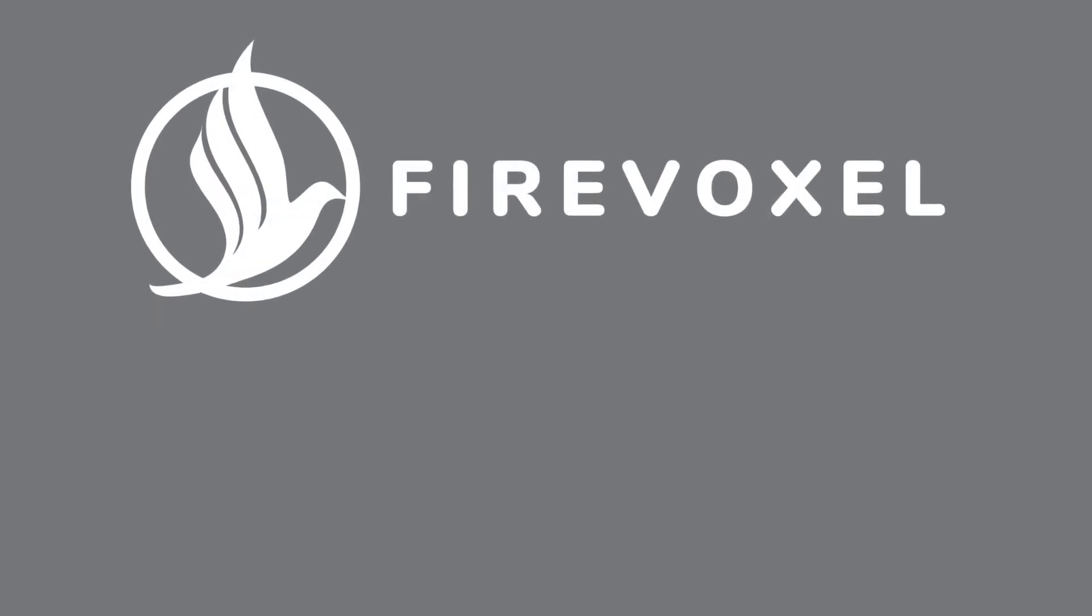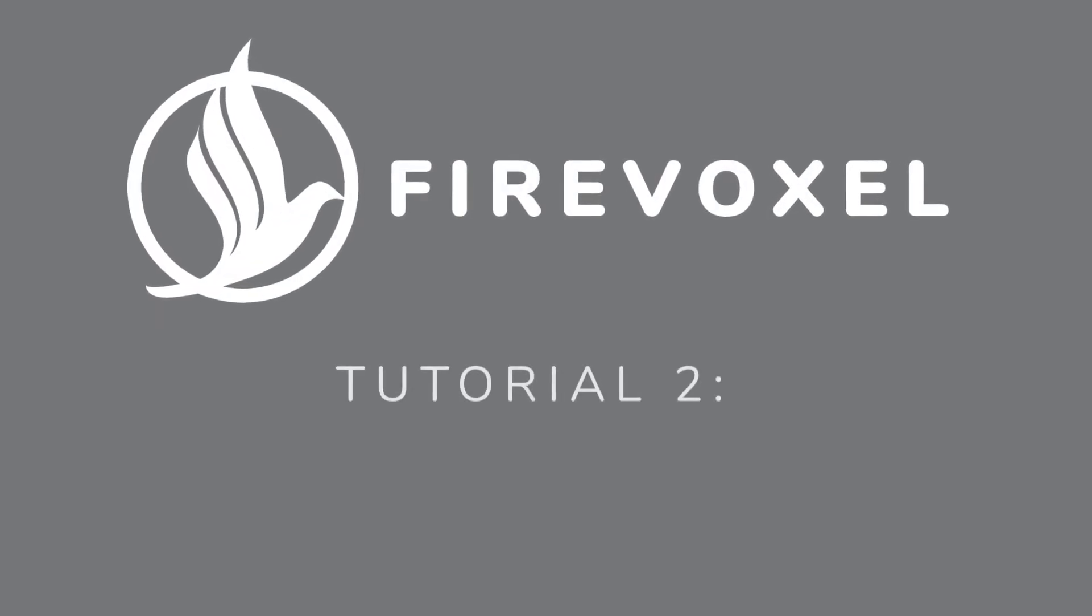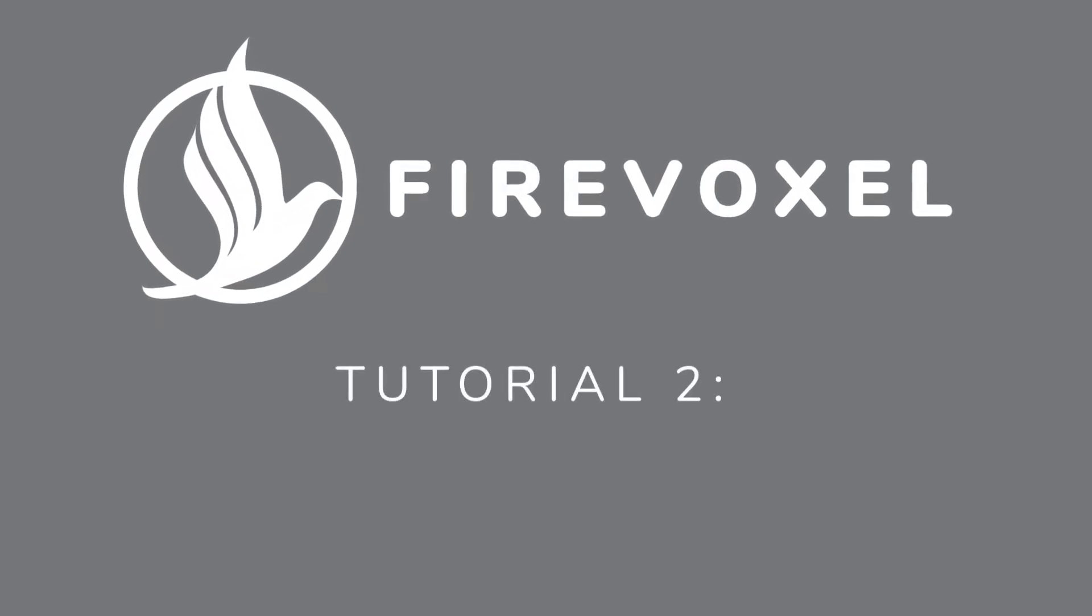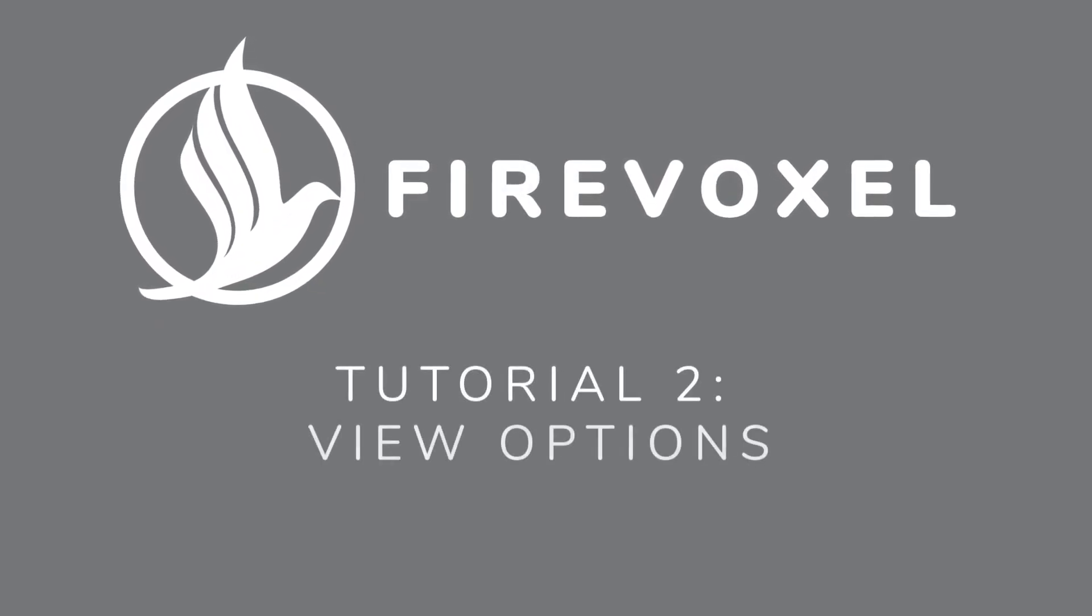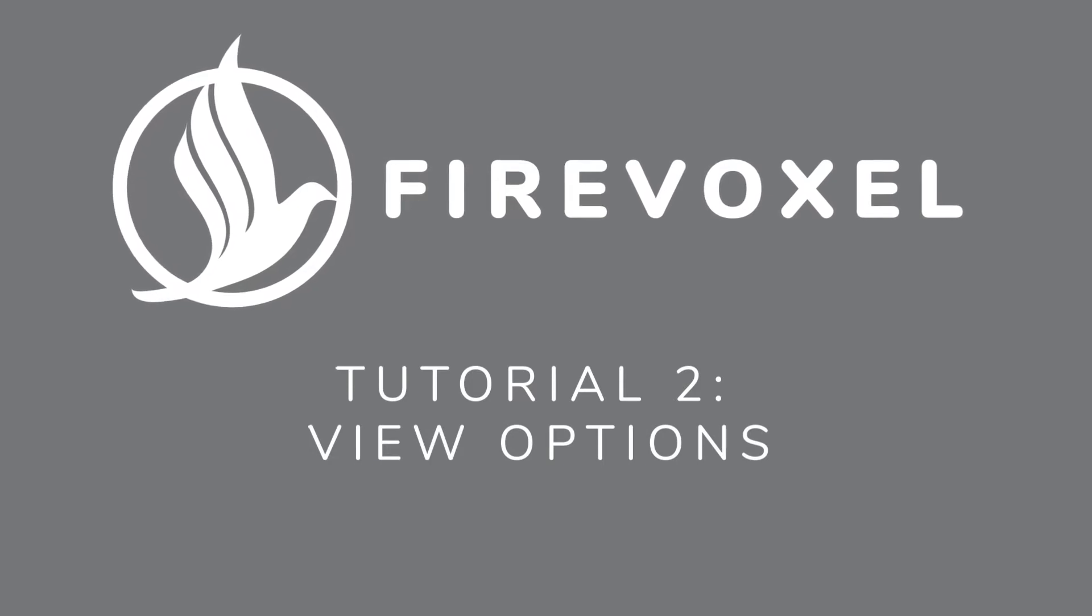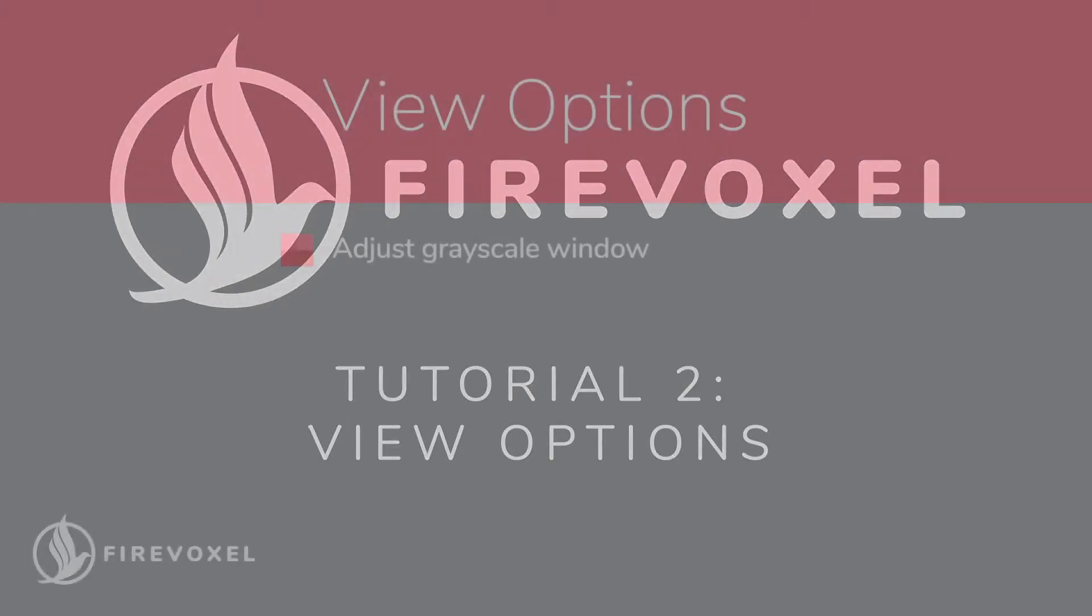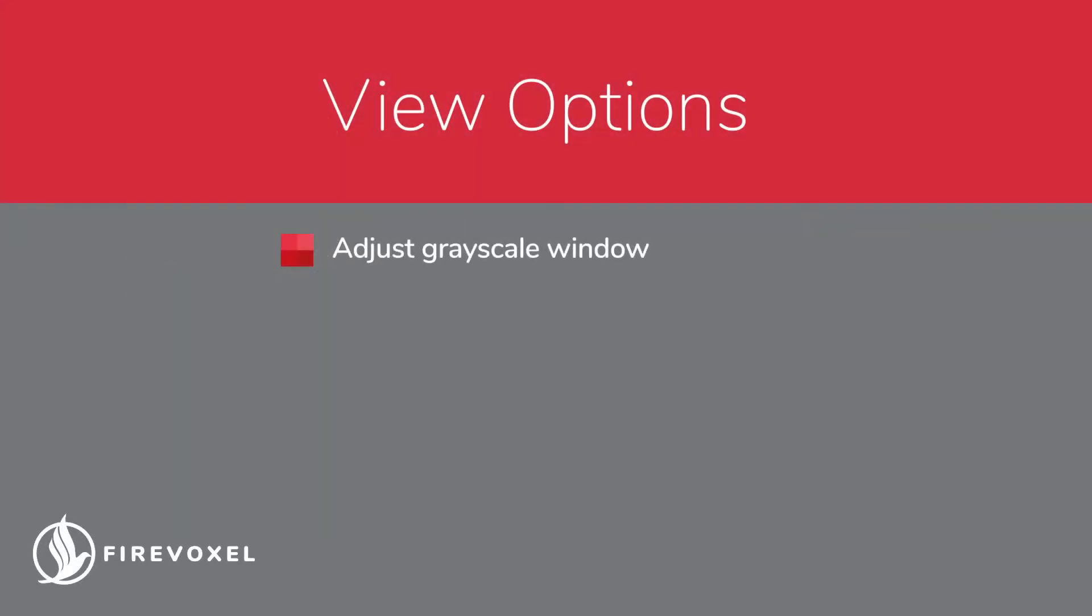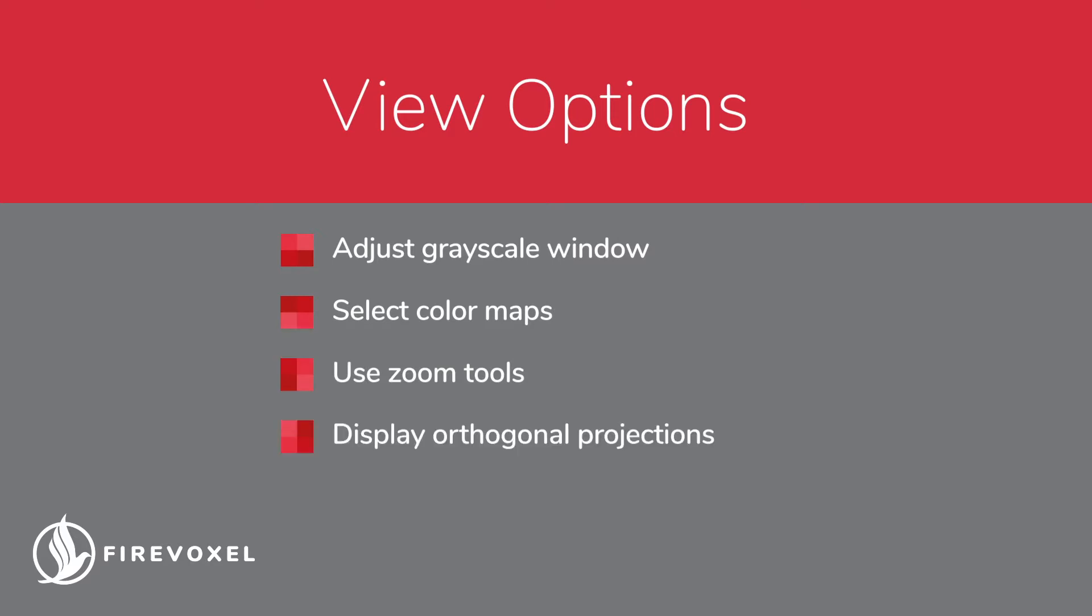Hello and welcome to the FireVoxel tutorials. In this tutorial, we will show you how to use FireVoxel to adjust the grayscale window, select the color maps, use the zoom tools, view images in different orthogonal planes, and customize the user interface.